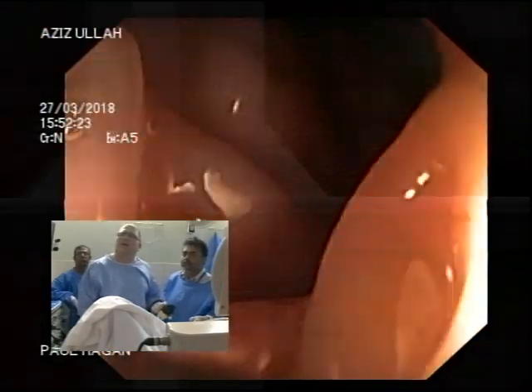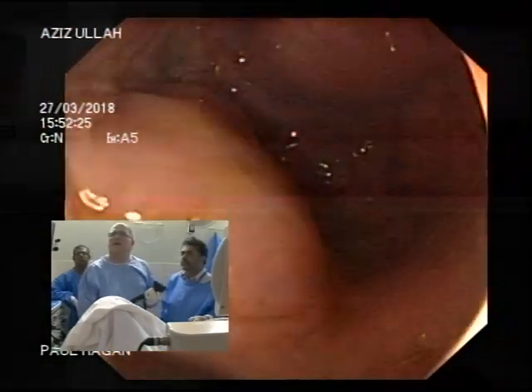You hold those rags because it makes you feel comfortable. But what it does, it stops you feeling the scope. And you need to feel the scope. See what I'm doing? I can actually feel the scope. I can feel what it wants to do. Now, if I didn't have scope guide, I would definitely say you've got a loop. And that's why the scope feels the way it does.